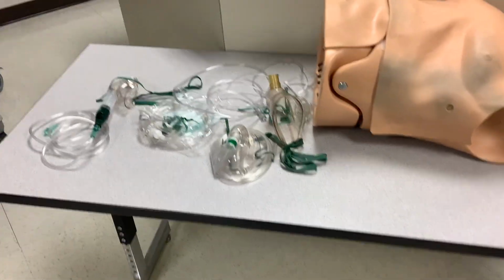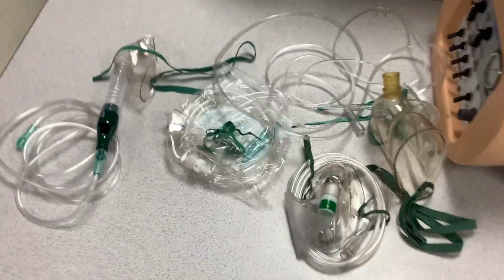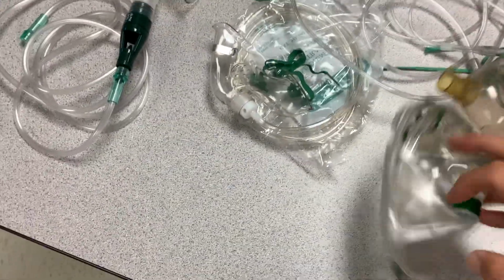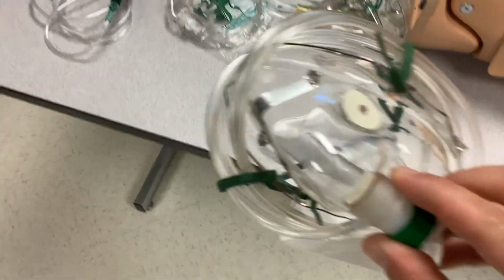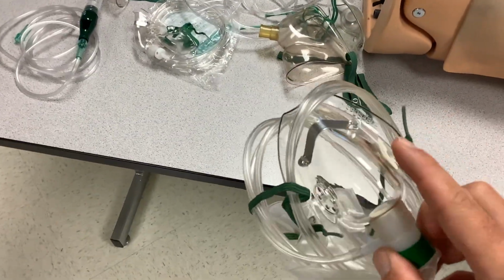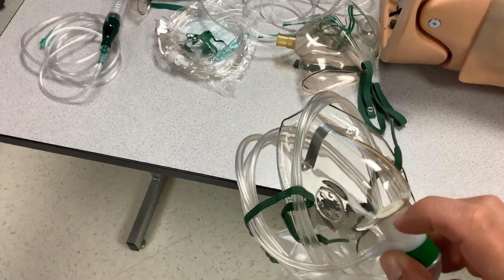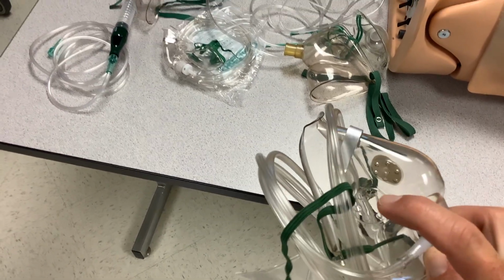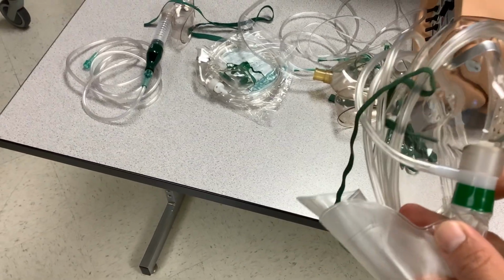So the first thing we'll look at are some of the items that we've got there. We've got a non-rebreathing mask, which is here. This non-rebreather mask is what's considered to be a partial rebreather. Notice that you've got a one-way valve here, a one-way valve here, and nothing over here. If this were a true non-rebreather, there would be another valve here. You've also got a reservoir bag.